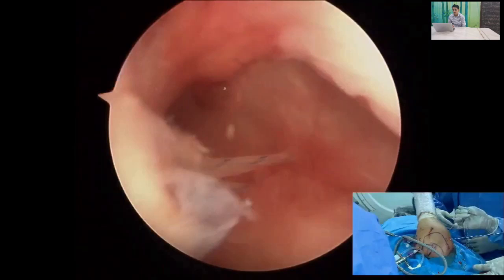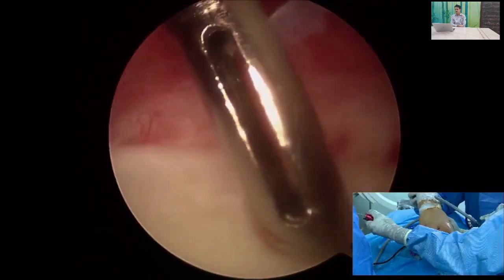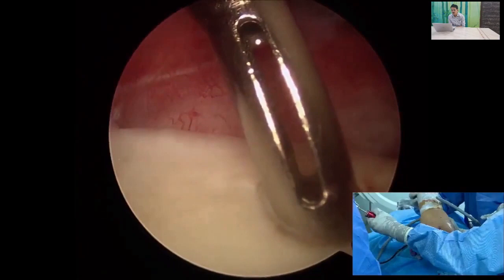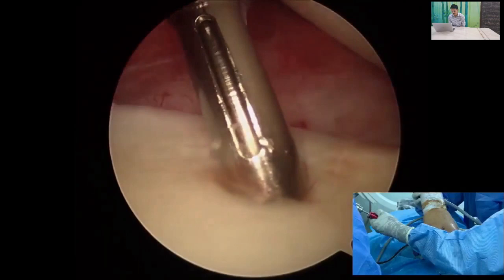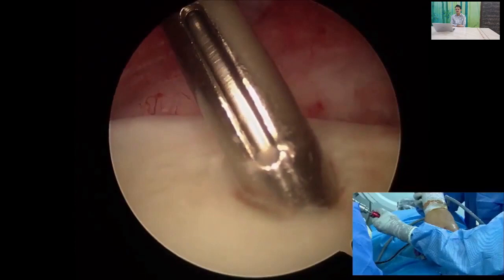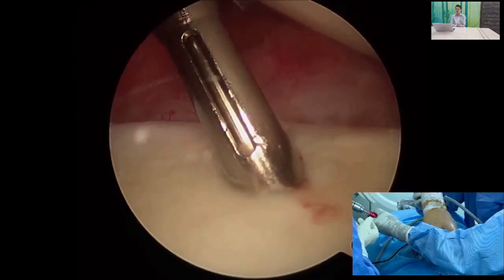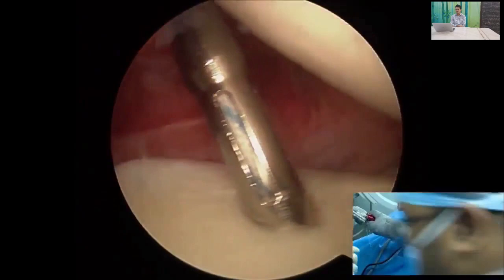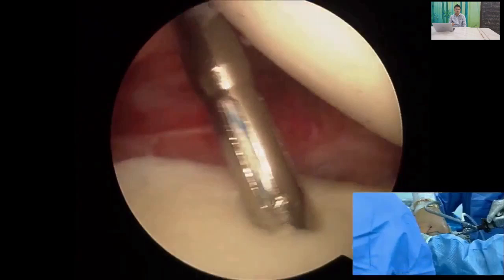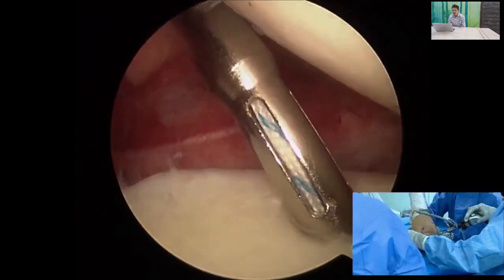Now we proceed with the arthroscopic labral repair. Having released the ALPSA tissue, we insert the first anchor at approximately the 5:30 o'clock position. In this case we use a single-loaded iConix anchor — a simple technique suitable for beginner surgeons. Insert the anchor from the anterior portal, remove the inserter and guide sheath, then retrieve one thread through the anterior superior portal so that one thread is in each cannula.